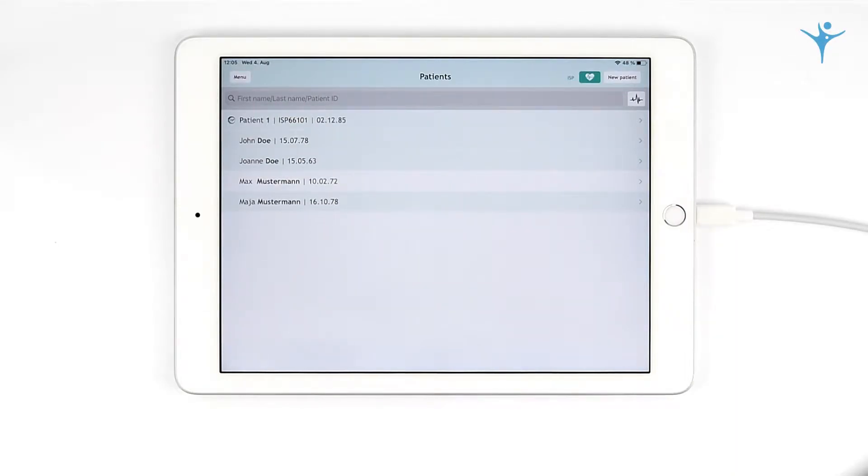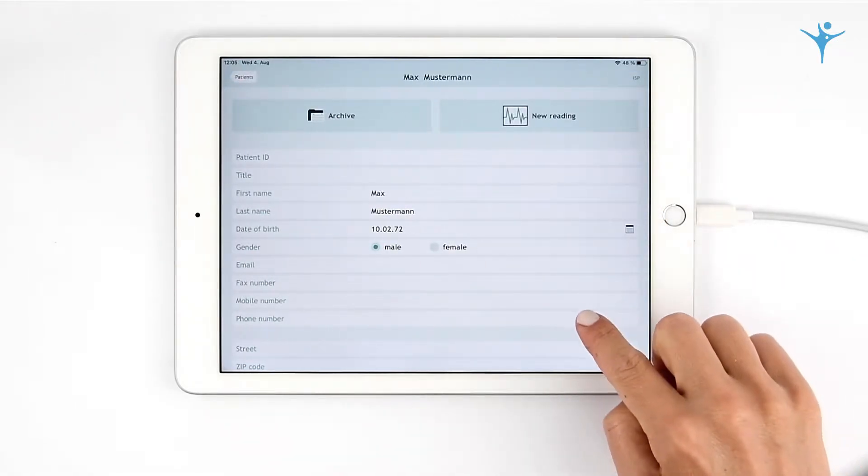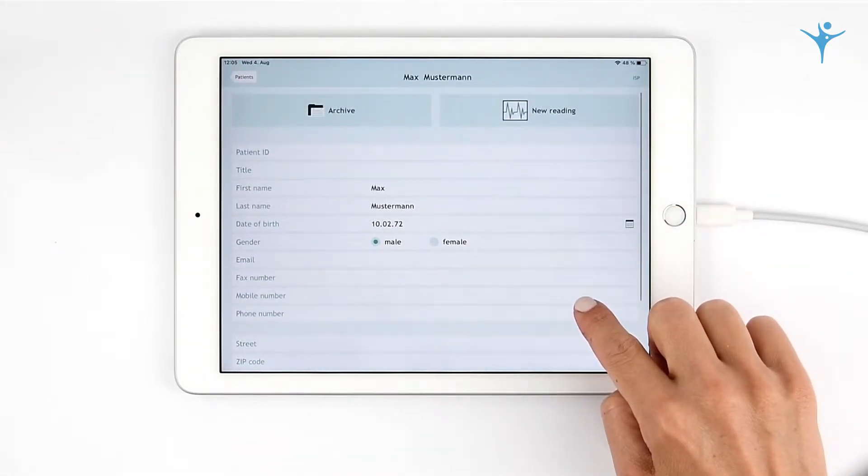CardiSecure Pro — the high-end mobile ECG for iOS devices. Manage your patient's data and perform new readings.